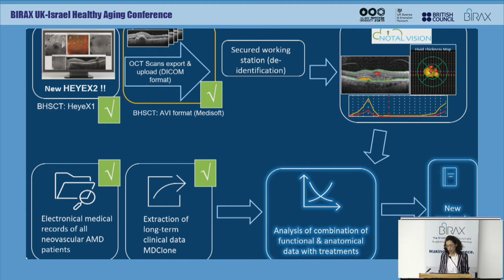In Tel Aviv, we did this by upgrading our system, as I just showed you, and in Belfast, they were able to extract the images with the help of a company called Medisoft. This project would not have been possible without the immense help that we get from the IT, from the computer department in Ichilov, which is really part of our project and supporting us in each step.